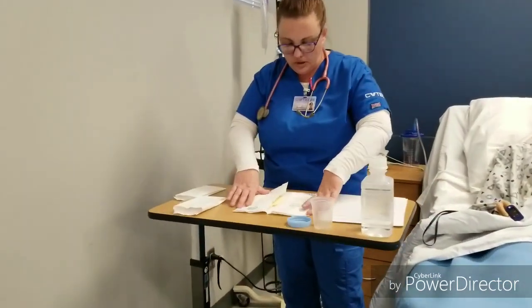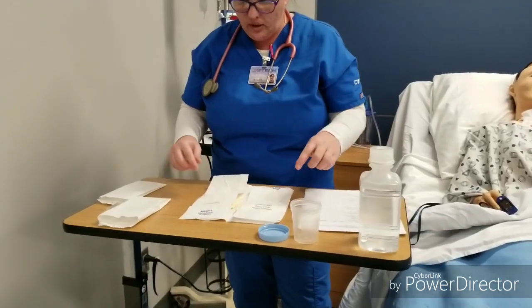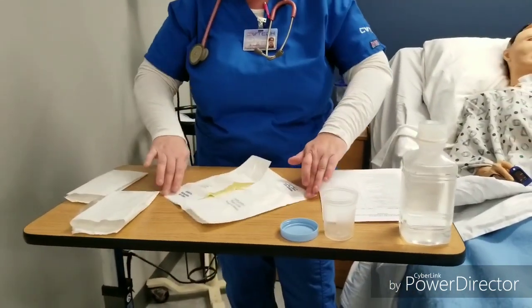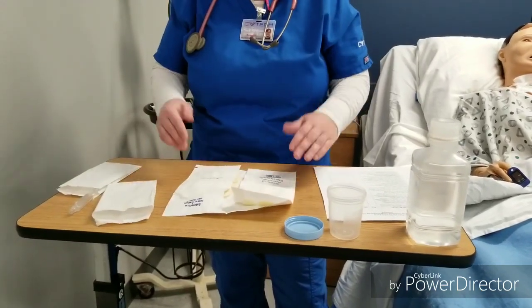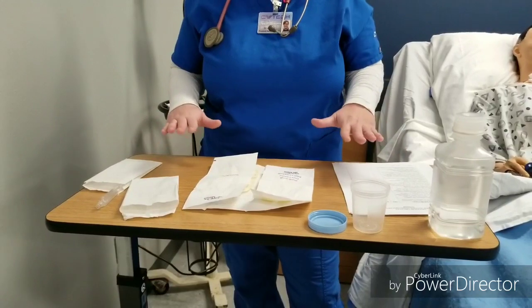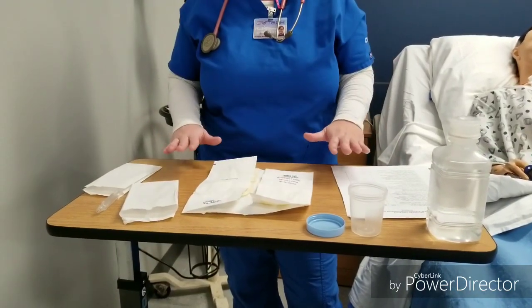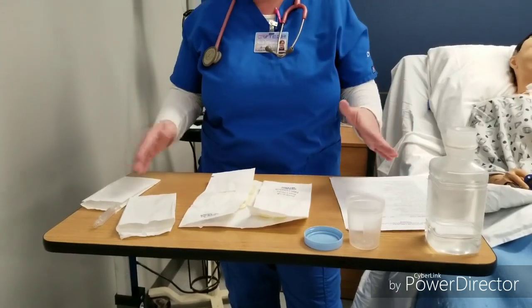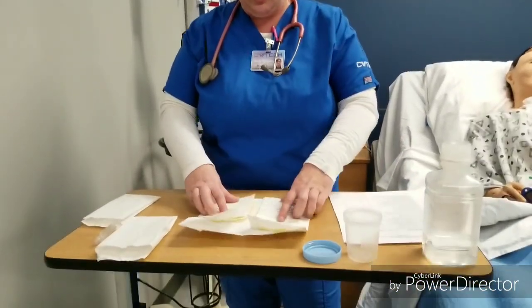And you want to examine this. There will be a top and a bottom, and you see where your cuffs are. You want to turn this around to where the cuffs are facing you, and make sure the height of your table is not too far below waist level, because anything below waist level, you have contaminated your field.